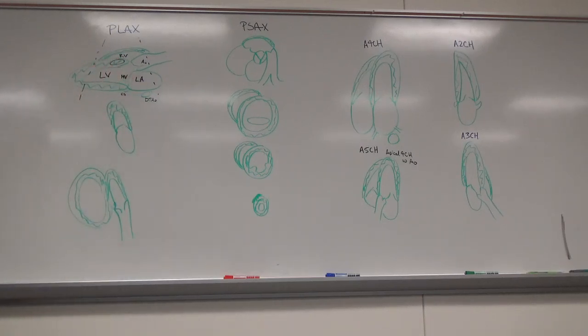So we need to be able to evaluate that. The septum actually has different components to it in the 17 wall segments. In the wall segments we have levels. So we've got the base, which is going to be close to the valves, the mid portion, and the apical portion. So when we draw out the 17 segments, we're going to have to distinguish those.